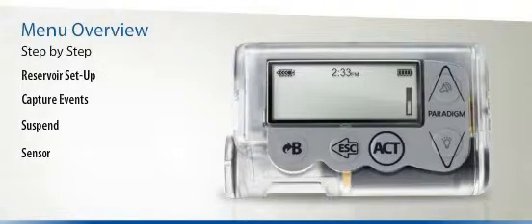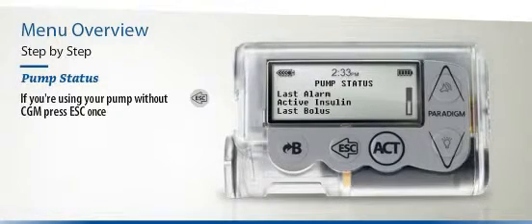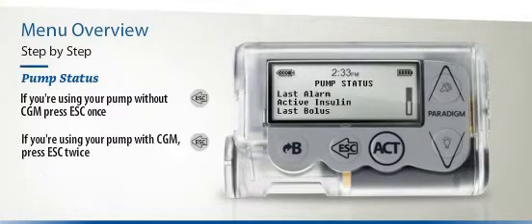Go ahead and try it to see how easy it is. The Pump Status screen is the place to go if you'd like to know all the latest information about your pump. If you are using your Paradigm Veo only as an insulin pump, press Escape once to reach your Pump Status screen. If you are using your Paradigm Veo with the Continuous Glucose Monitoring option, press the Escape button twice.